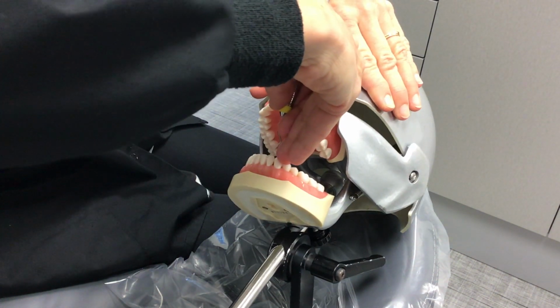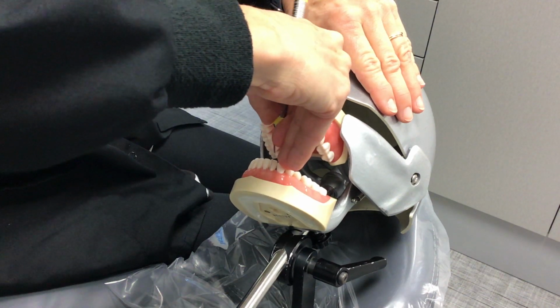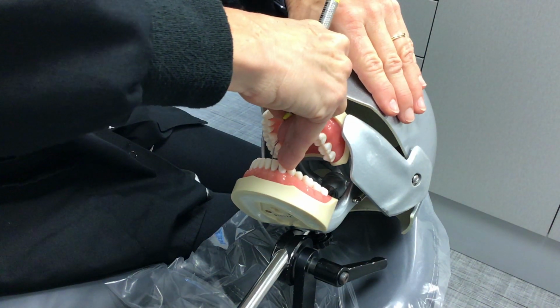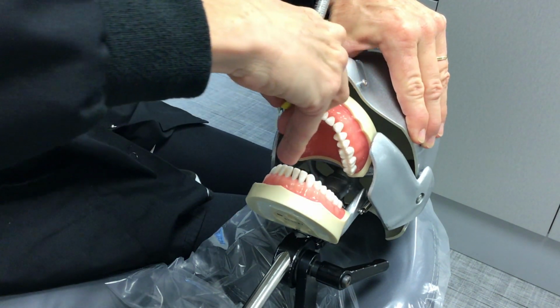I will fulcrum again, my fulcrum extended, and I will insert and walk across into the interproximal area, and again turn my patient and continue all the way to the canine.